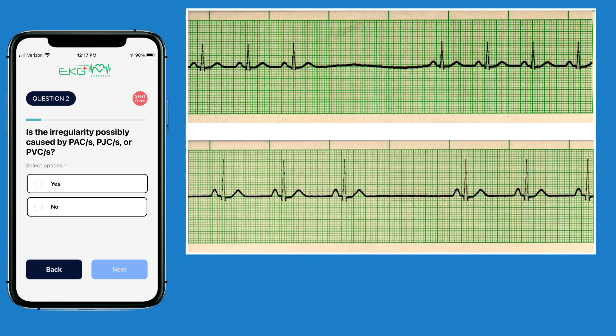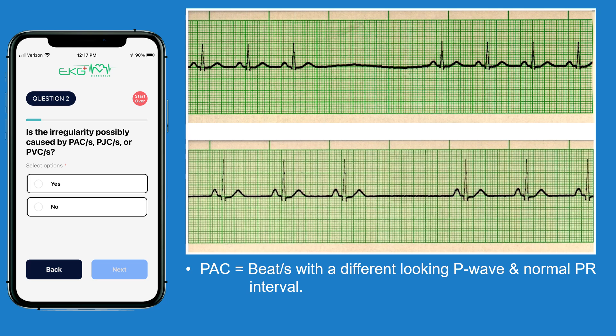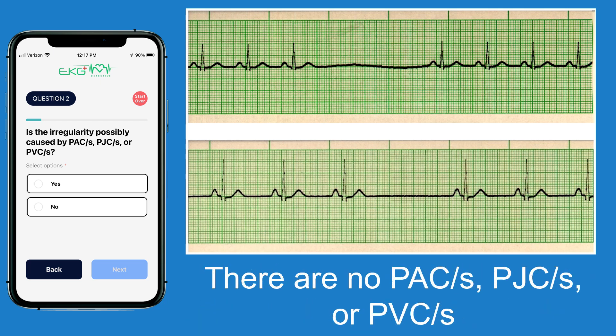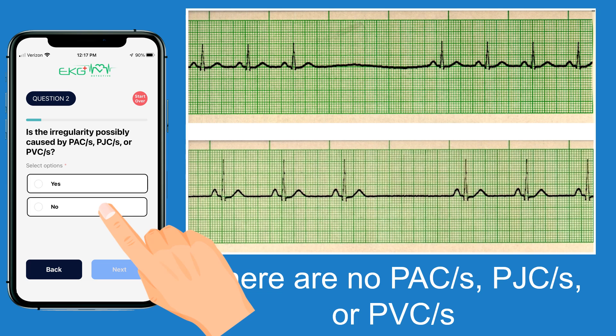Question two asks if the irregularity is possibly caused by PACs, PJCs, or PVCs. A PAC will have a different looking P wave from the underlying rhythm, but the PR interval will be normal between 0.12 to 0.20 seconds. A PJC will either be missing P waves, or if there is a P wave in front of the QRS, it will be inverted and retrograde with a PR interval less than 0.12 seconds. A PVC will have a totally different looking QRS complex compared to the underlying rhythm. Applying these criteria, it doesn't appear we have PACs, PJCs, or PVCs, so we select no and hit next.